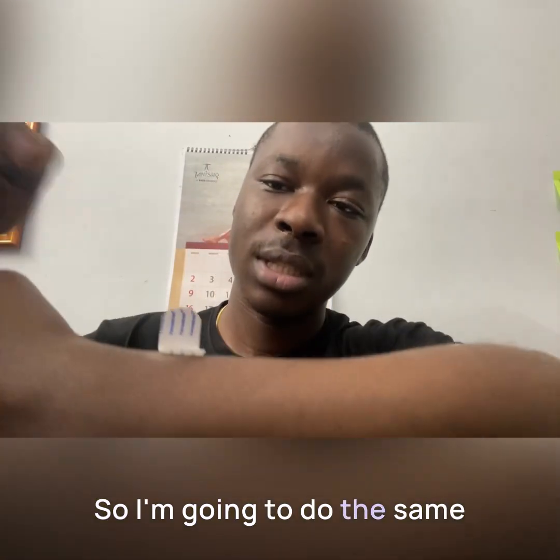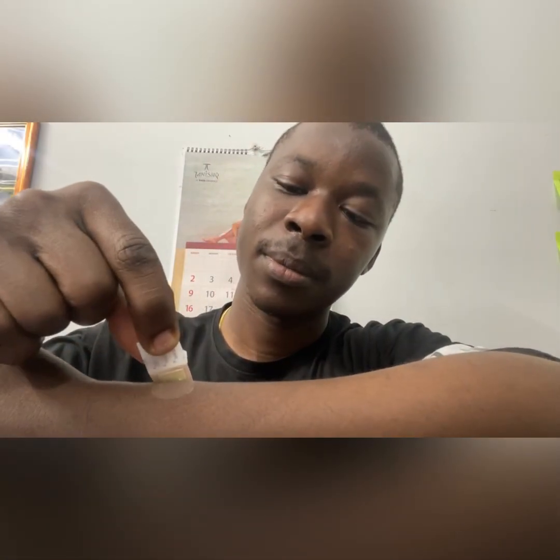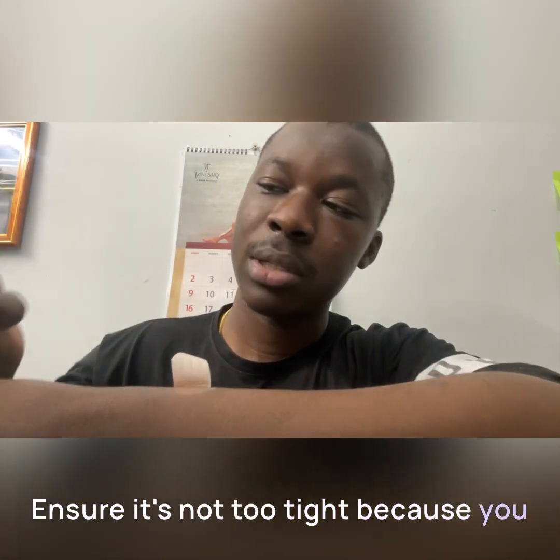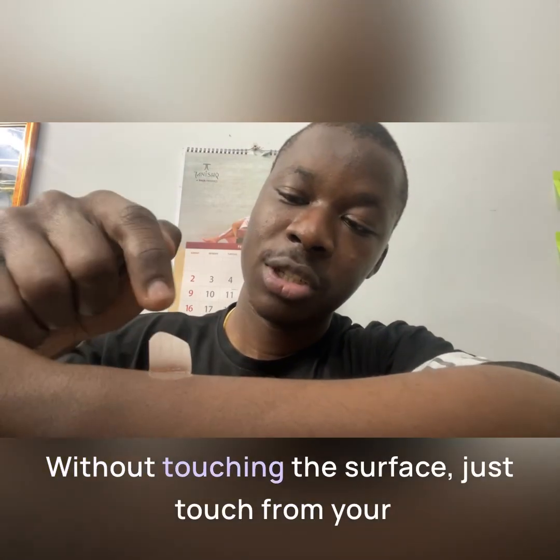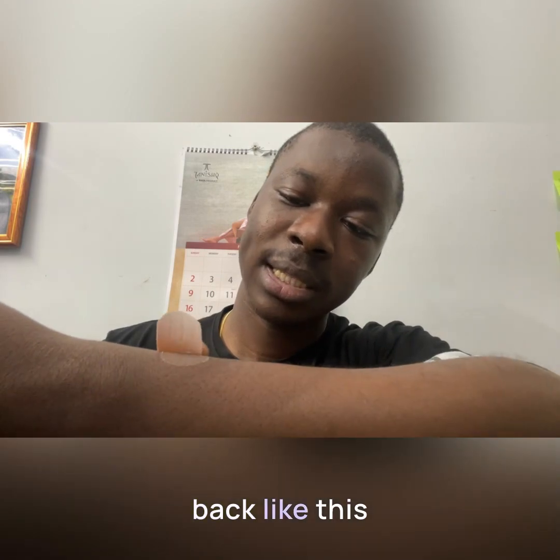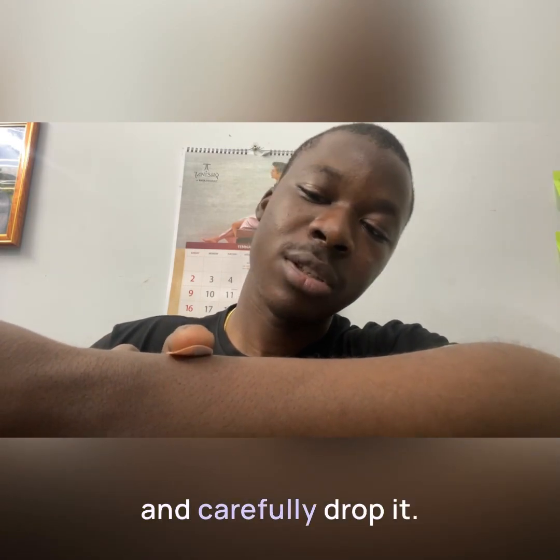I'm going to do the same thing on the other side as well. Carefully, ensure it's not too tight, because you don't want it to be too tight. Carefully, without touching the surface, just touch from the back like this and carefully drop it.